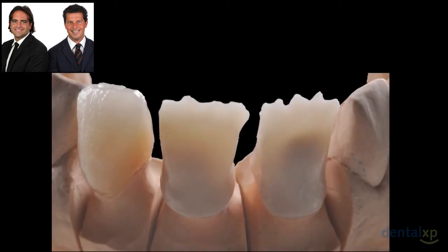And this is exactly what you just saw in the video: the frameworks on the model. You can see how important it is to work with the highest quality possible of zirconia, because you can see how translucent this zirconia is, especially in this picture, on tooth number 8 on the top right.